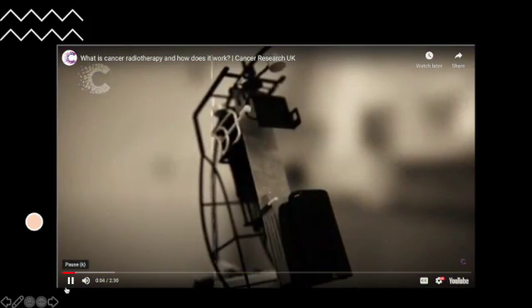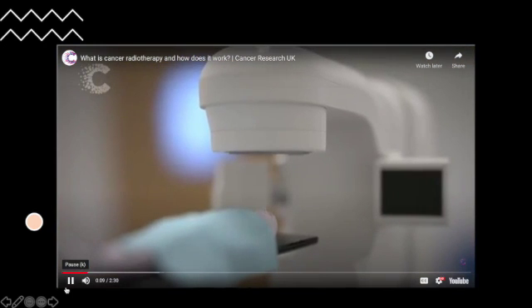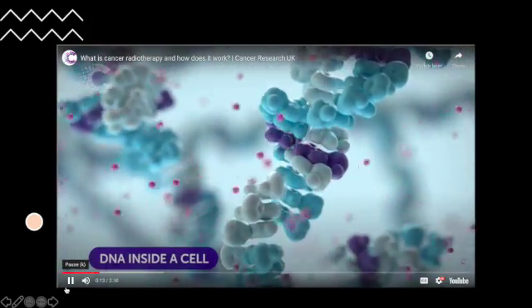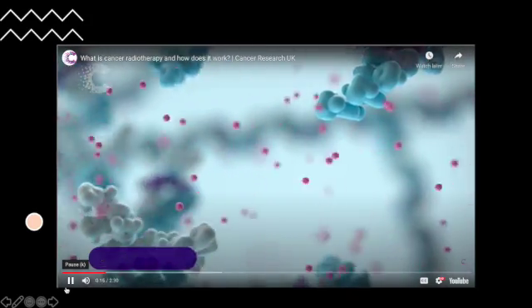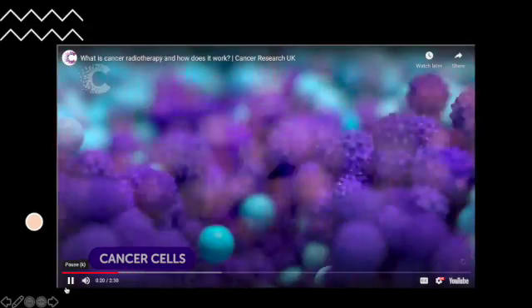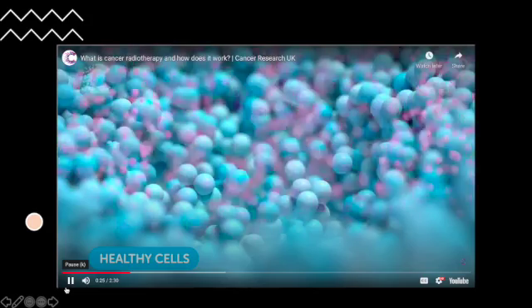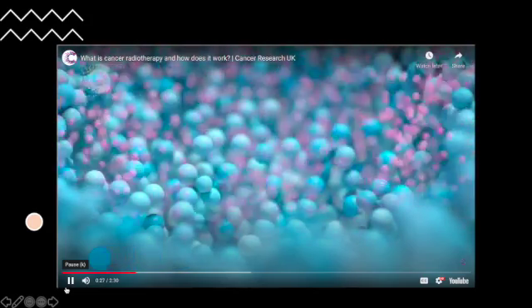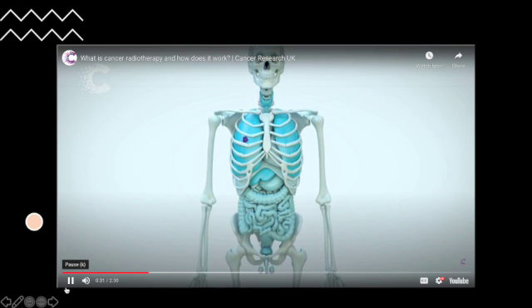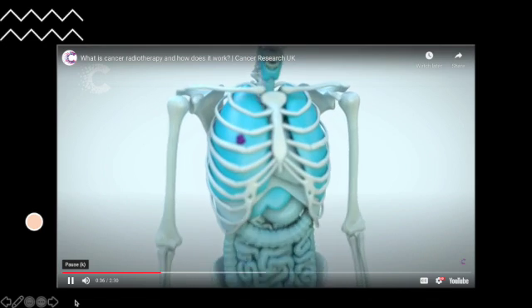Radiotherapy has been used to treat cancer for over a century. But new technology is making it modern and precise. It works by aiming intense bundles of energy at cancer cells, damaging their DNA. If a cancer cell can't repair its damaged DNA, it dies. But the radiation also damages nearby healthy cells. This is what causes side effects in neighboring tissue. Most radiotherapy is given from outside the body, usually using X-rays. And new experimental techniques are improving accuracy.